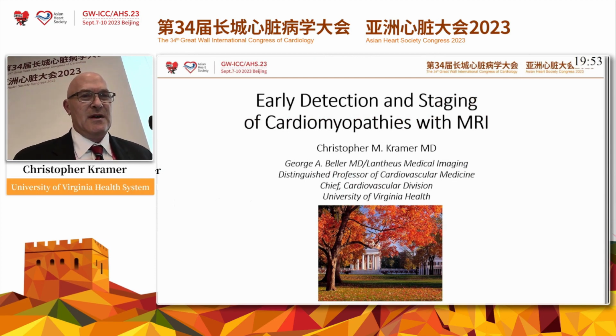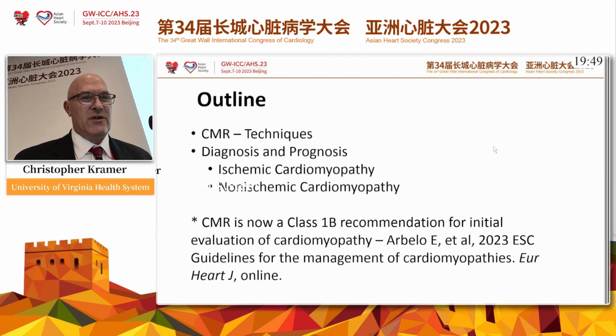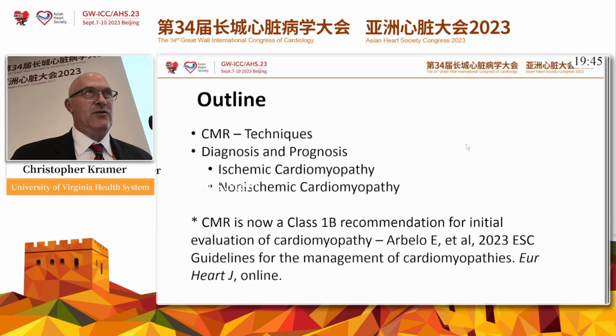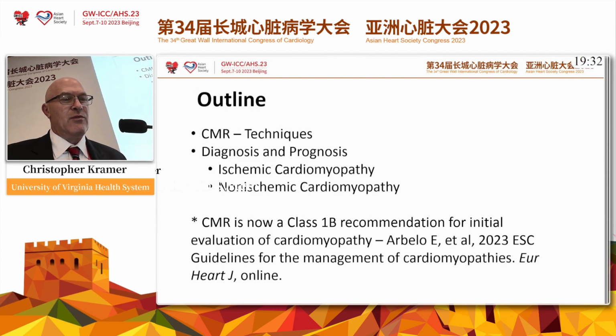We'll talk about MRI and the assessment of patients with heart failure. So I'll start out by talking about the techniques we have at our disposal using CMR, and then speak specifically about ischemic and non-ischemic cardiomyopathy and how we can use CMR to make a diagnosis and then to assess prognosis.